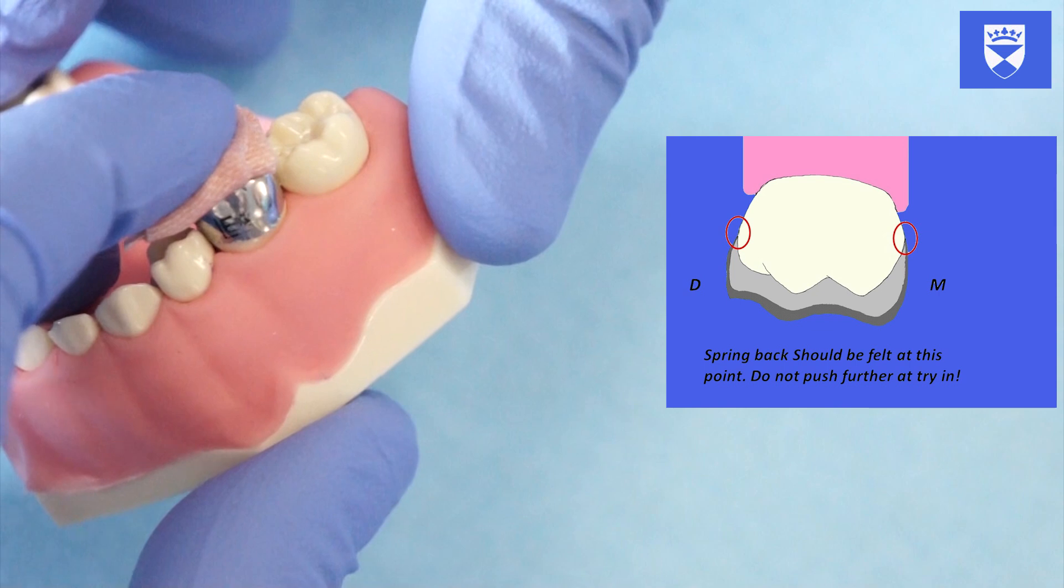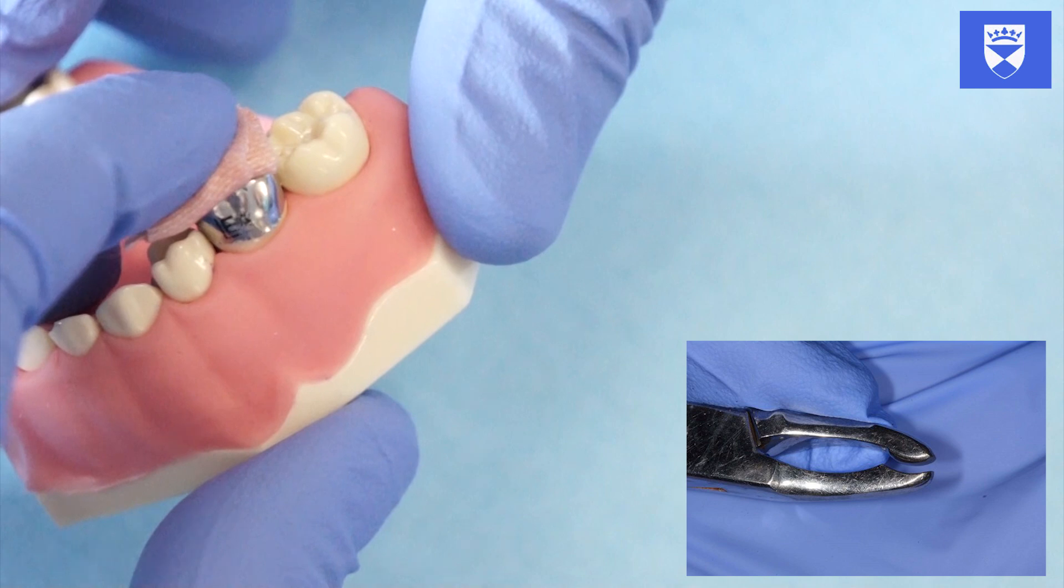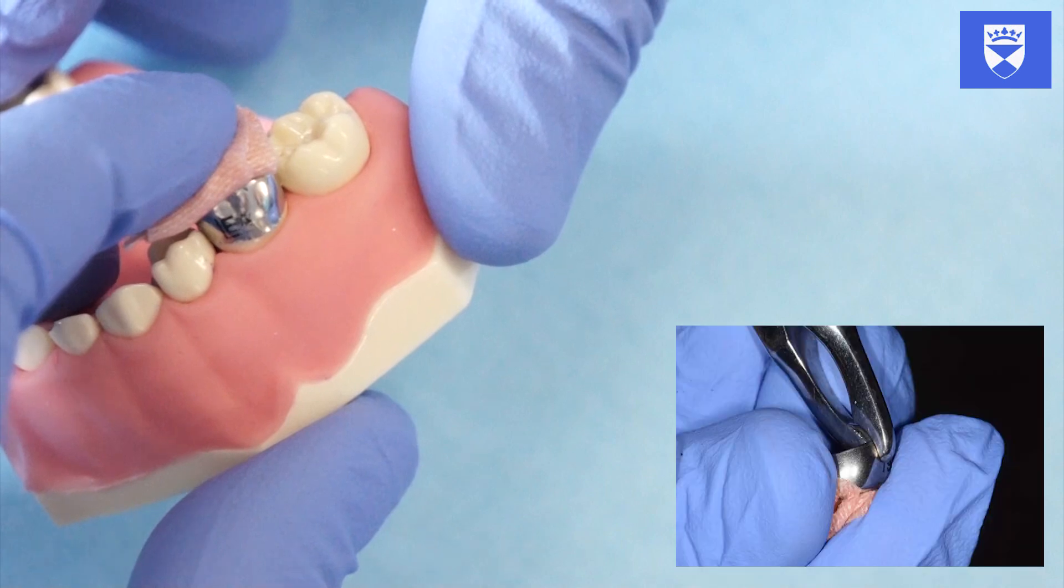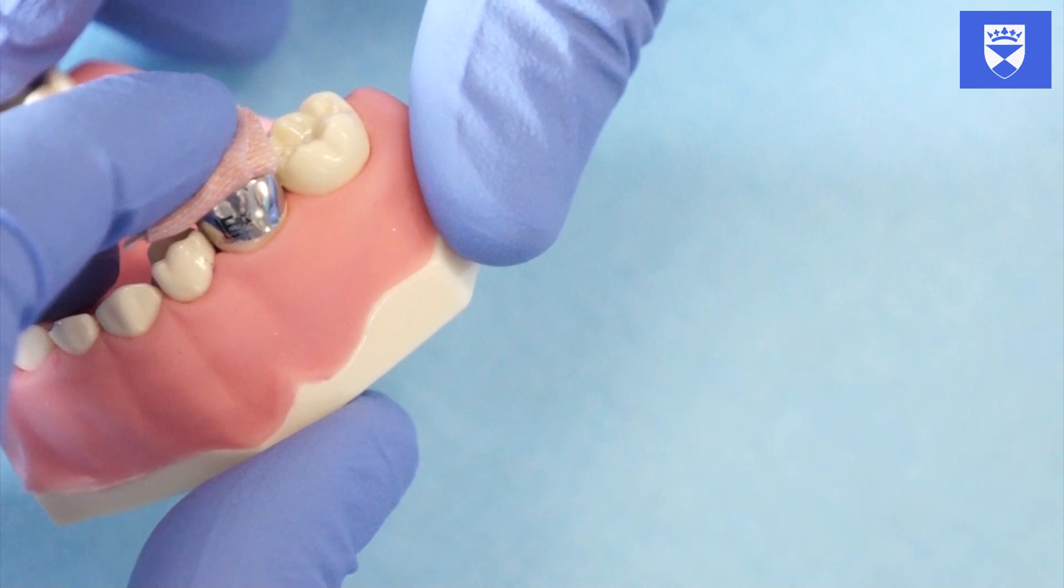If necessary, a crown may require adjustment with crown forming pliers. This will be demonstrated in your practical. Rehearse the path of insertion. Do this until you are confident that you can undertake this procedure with ease and ensure that the child is comfortable.